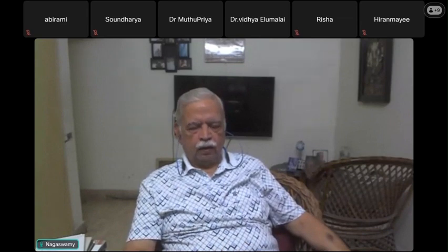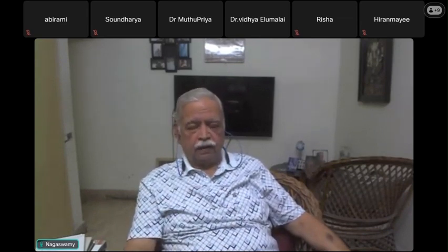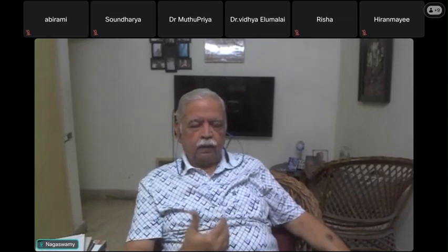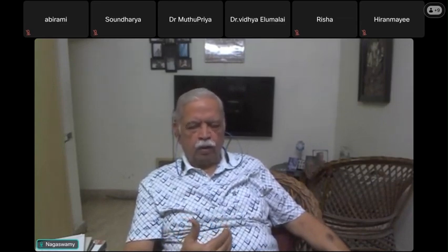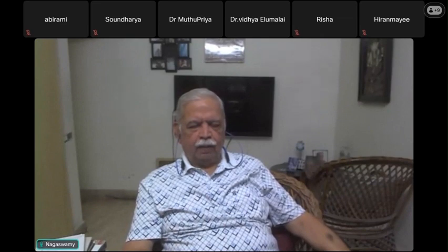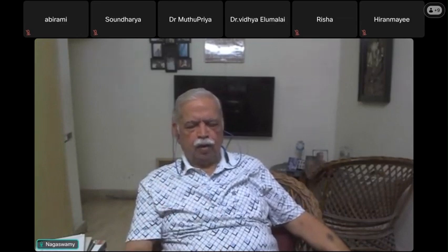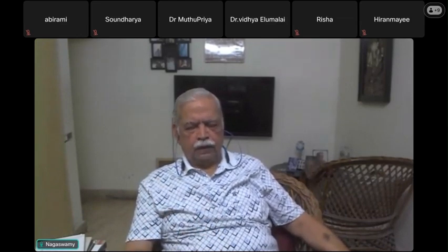So these are some of the practical tips you have to learn when you do a nasotracheal intubation in an anesthetized patient under general anesthesia. Then you have to talk about awake nasotracheal intubation, about which you talk only about blind nasal. But what is the method that we commonly follow nowadays when you want to do an awake intubation in a TM joint ankylosis patient or a burns contracture neck?